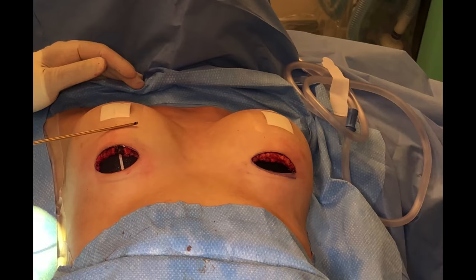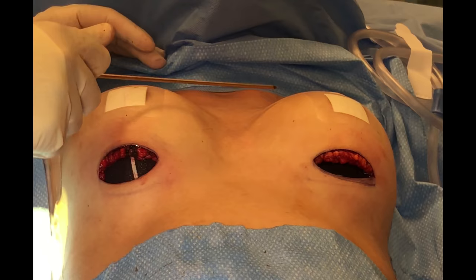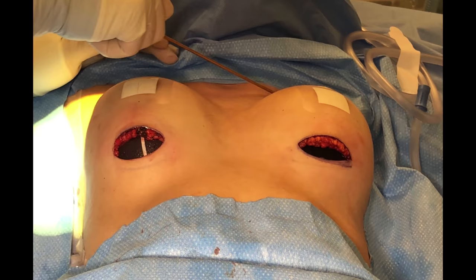In other words, this implant is going to stick further away from your chest with a more natural takeoff, whereas this is going to be a little bit flatter but have a more round and cleavage-attracting takeoff at the top.